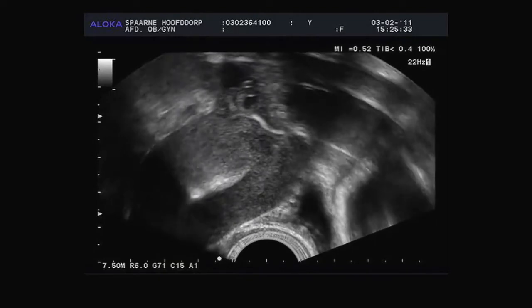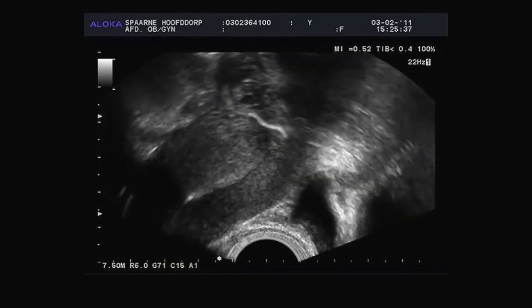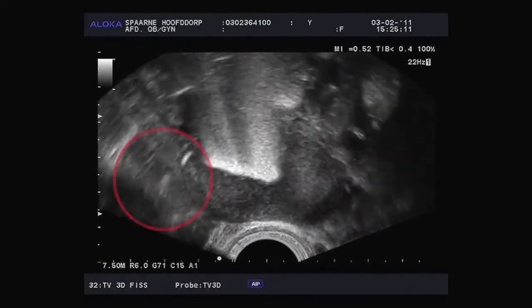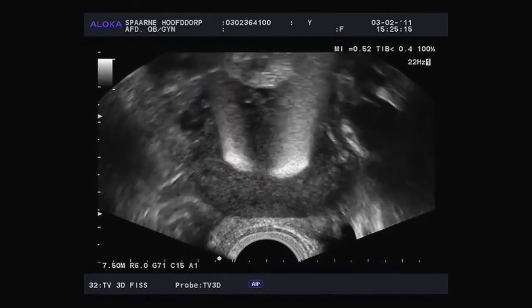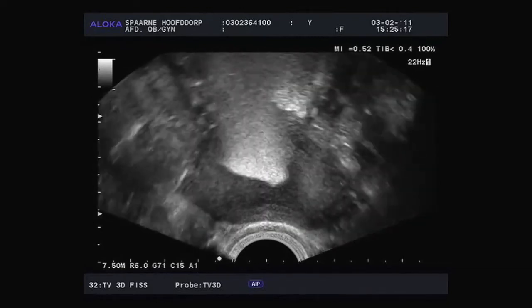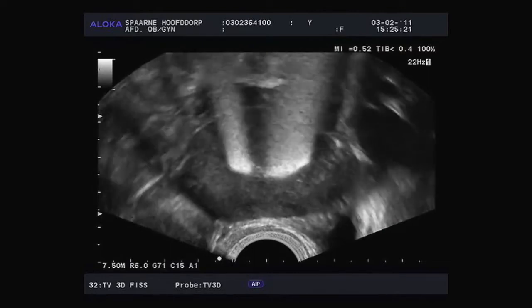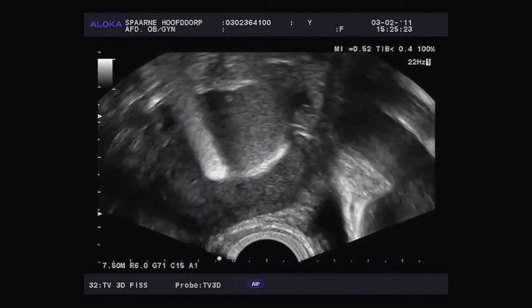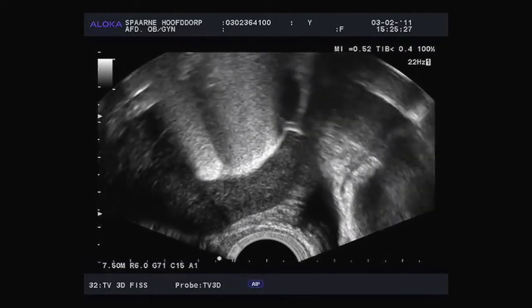Look — this is behind the womb. Here is a cross-sectional image. You can see how nice and thin the fallopian tube is, but it's even clearer in the next section. Now we'll look at the other side first. See how the fallopian tube makes an enormous bend — but that's also clear to see. Behind the womb, there's a very nice, thin, winding fallopian tube.